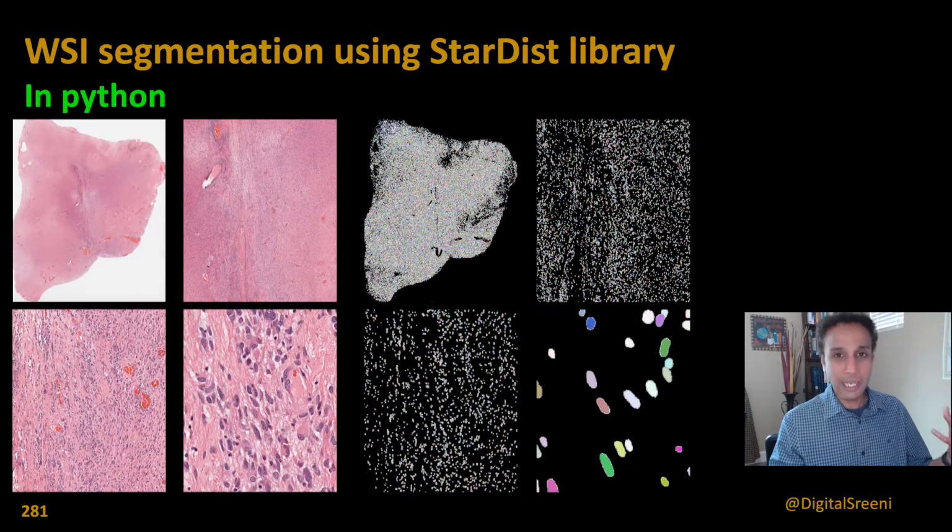So this is a whole slide image. And let us go ahead and jump in. And if you cannot relate to what a whole slide image is, if you come from remote sensing or some other background, I still encourage you to watch this video so you get good ideas in terms of how you can implement this for your specific type of research or job.